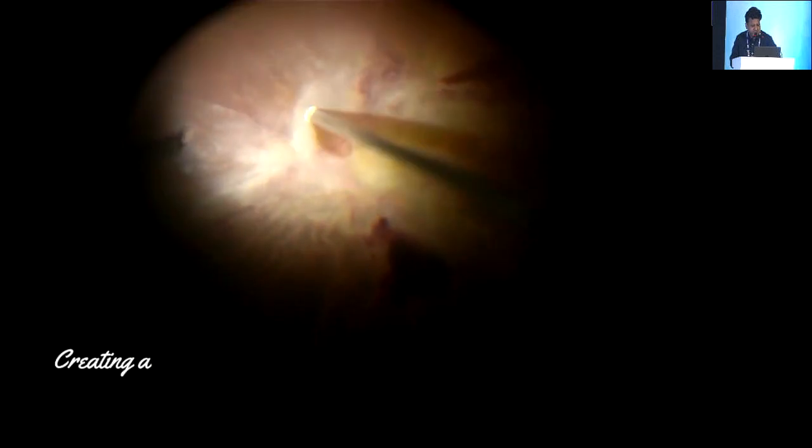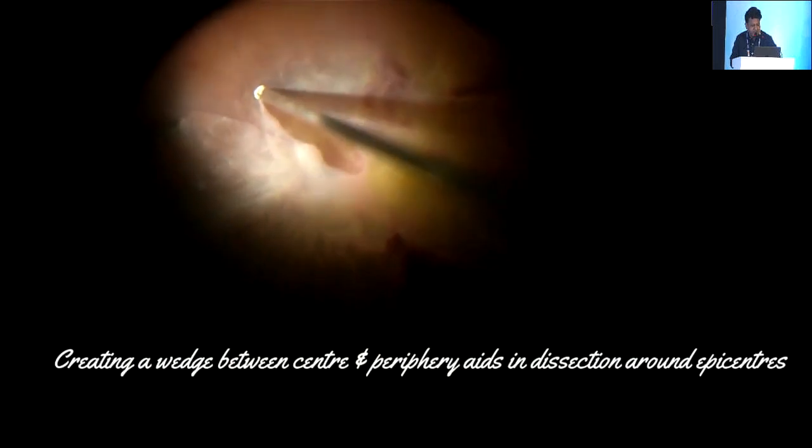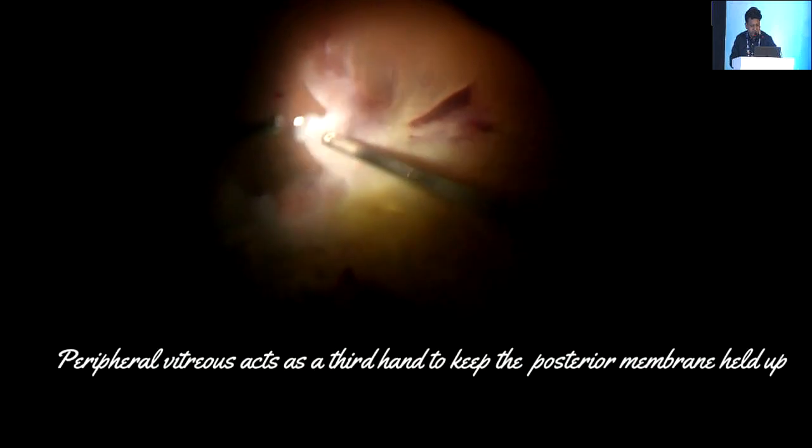Again, in this patient, I just went ahead, created a plane of dissection by removing the membranes at the optic nerve head, and then I created a wedge connecting the central retina with the peripheral retina, and now I am inducing the PVD in the peripheral retina, and this way you can remove the membrane from all the sides, and it becomes easier.